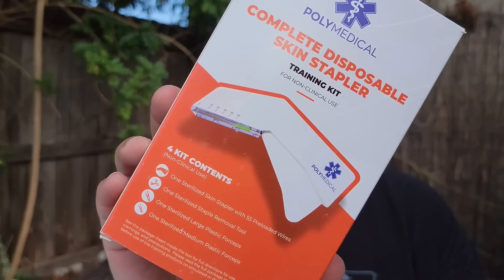What's up everybody, this is Gray here. Today we're going to look at medical preparedness. Specifically, a company called Polymedical reached out to me and asked if I could review one of their products. I'm going to unbox the product, show you what's in it, and show you the proper application — my way and how I was taught — on how to use a skin stapler, specifically this kit right here.